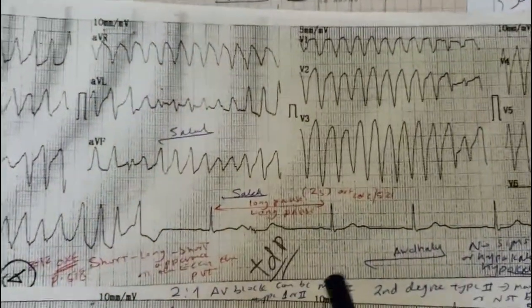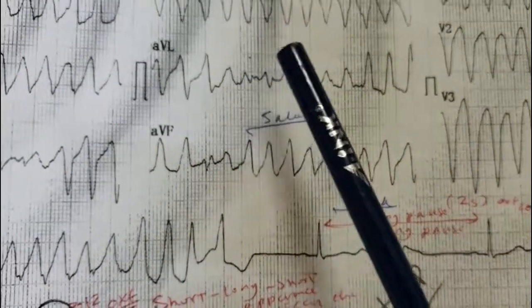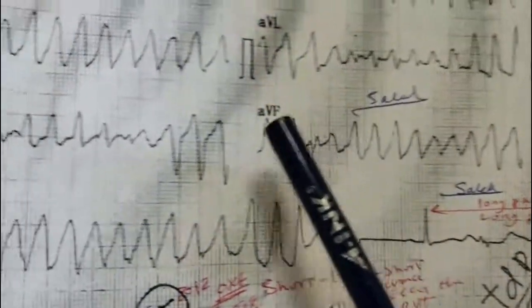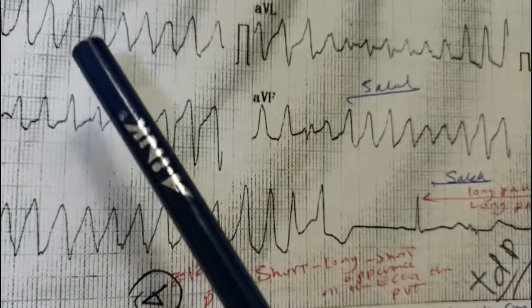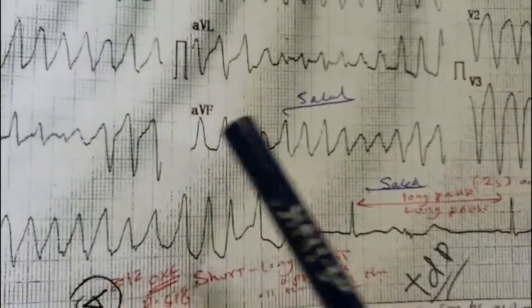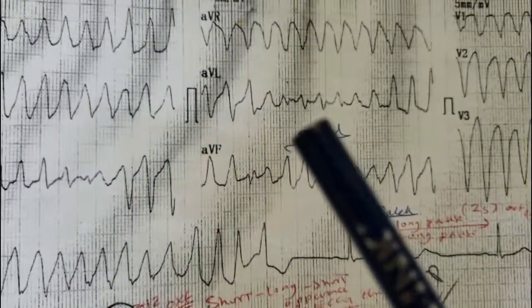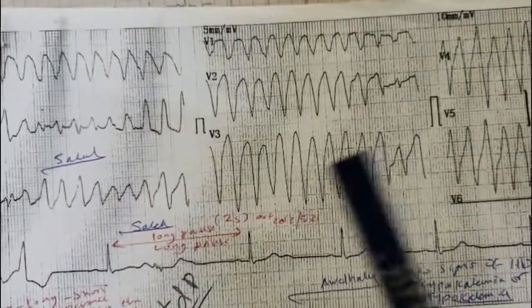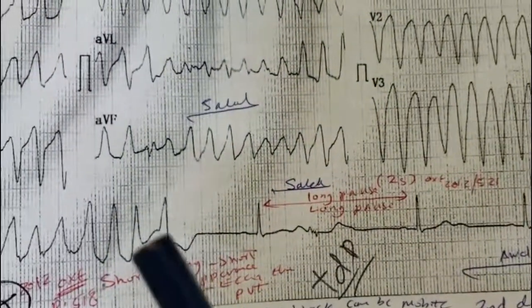Please look at the following ECG. Look at the waves. They are different in amplitude and width and also in direction, when some complexes go up and other complexes go down around this axis in the same lead. This is called polymorphic ventricular tachycardia, caused by electrolyte imbalance, and characteristically named Torsades de Pointes.